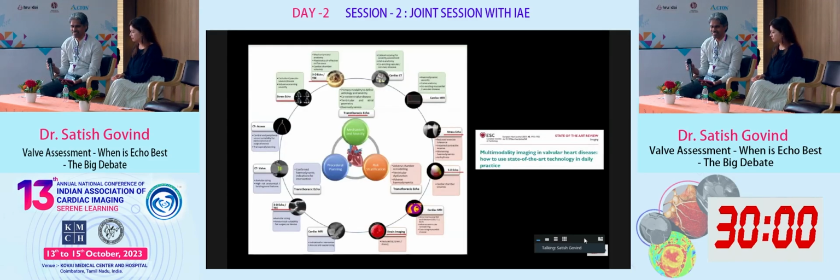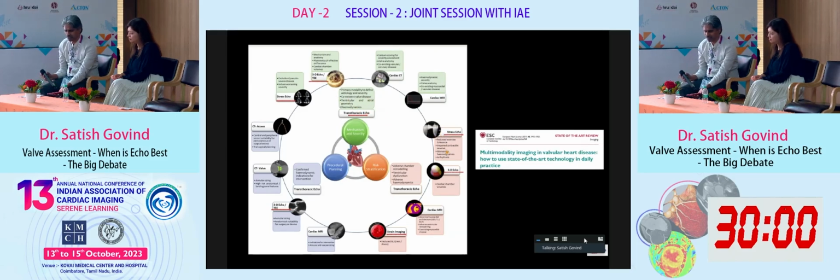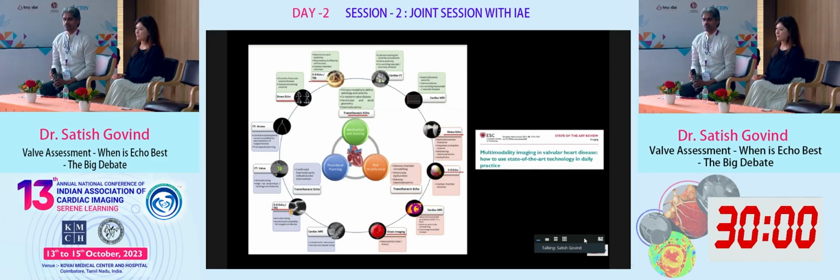So this is my final slide, to show that when it comes to mechanism and severity, procedural planning, and risk stratification, you have transthoracic echo in the center, and only when certain more information is required does the circle expand. And as far as echo is concerned, we have stress echo, 3D echo, strain imaging, and then you have 3D TEE. So these are the other techniques which help in making echo a primary imaging tool.